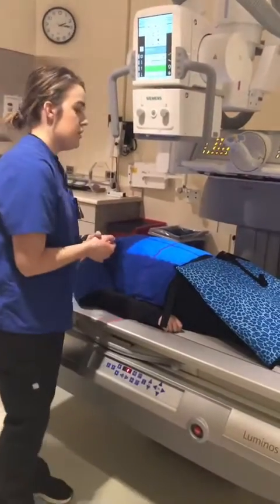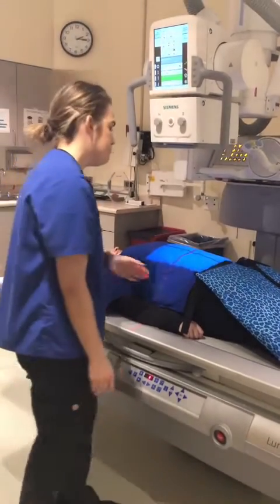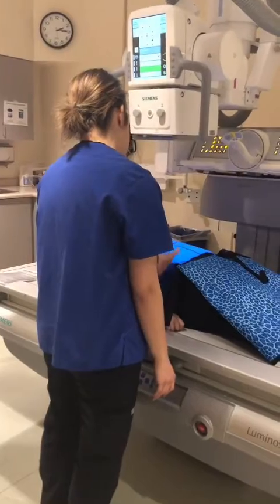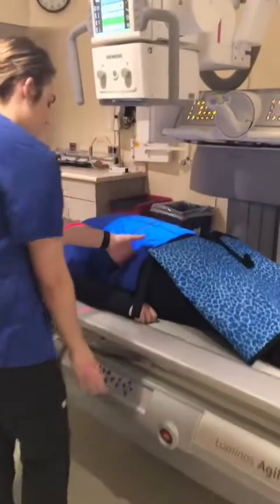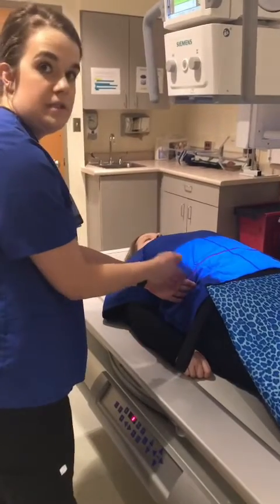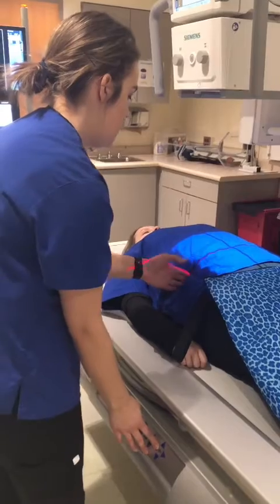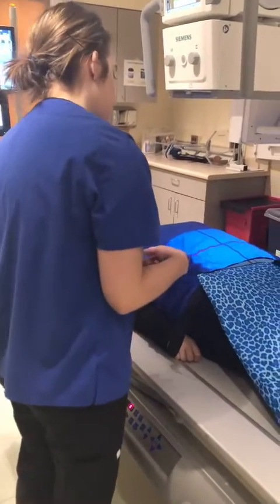And then next I'm going to palpate for the iliac crest. So, iliac crest on the patient here. I'm going to make sure that I have that centered. That red line right here is going to be right where I'm going to center, at that iliac crest. So I'm going to move the patient here, and there is the iliac crest right there.